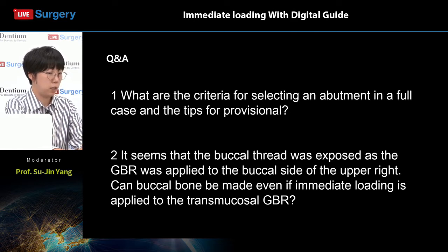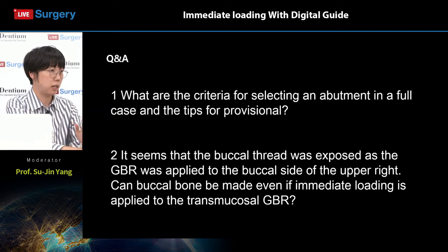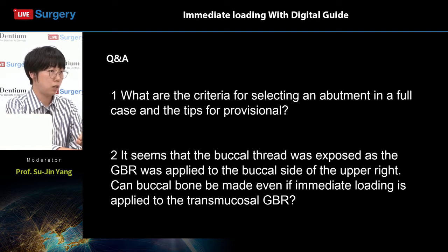After that, if your provisionals have enough posterior support, then you can have the provisionals for some amount of time. And if the other implant areas have increased stability over time, then you can maybe add more abutments above those implants and establish, say, a mutually protected guidance. But in most cases, a full mouth case is usually done in elderly patients. So usually a group function occlusion can be made for your full arch provisionals.